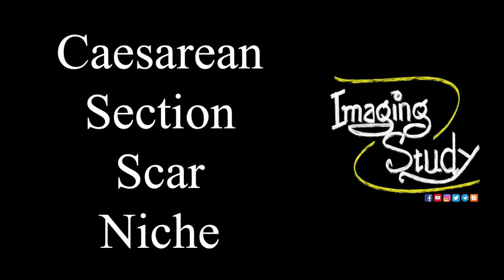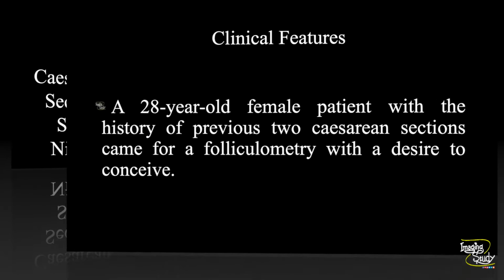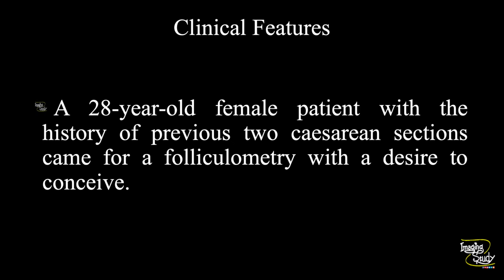Today we are going to see a case of cesarean section scar niche. A 28-year-old female patient came with a history of previous 2 cesarean sections. She came for a folliculometry with a desire to conceive again. Let's see what we have got on ultrasound.